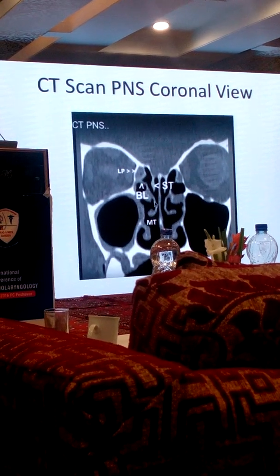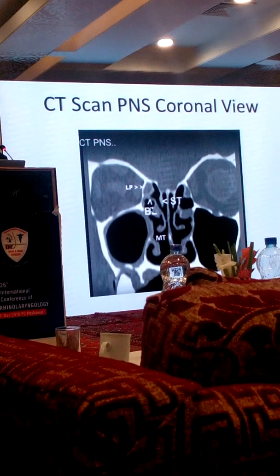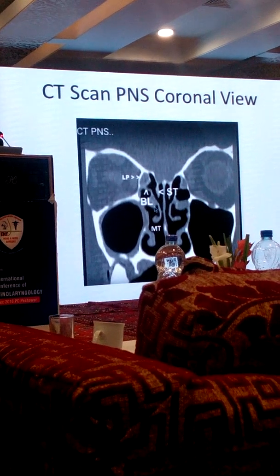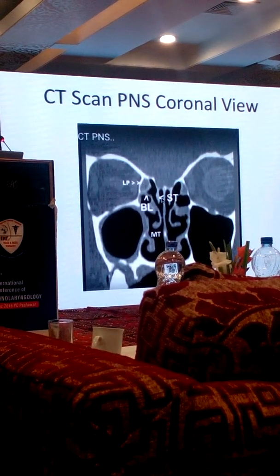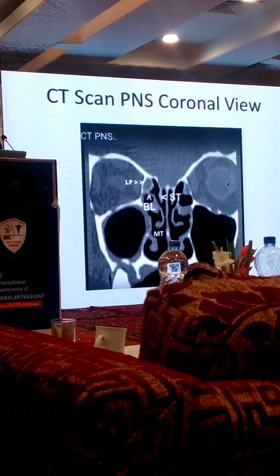The middle turbinate, now going over here. Anteriorly, it is attached to the junction of the cribriform plate. Posteriorly, it is attached to the lamina papyracea. So this is the basal lamina, sometimes we call it the third lamina, and any cell posterior to that is the posterior ethmoid. Incidentally, superior turbinate is over here. So very clear orbit. We can see all these things.